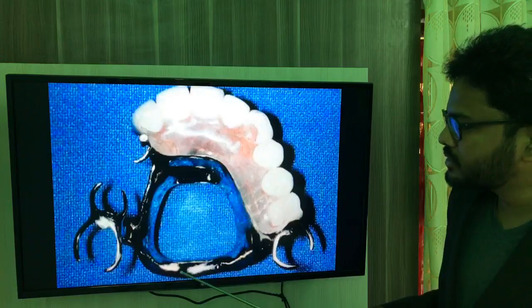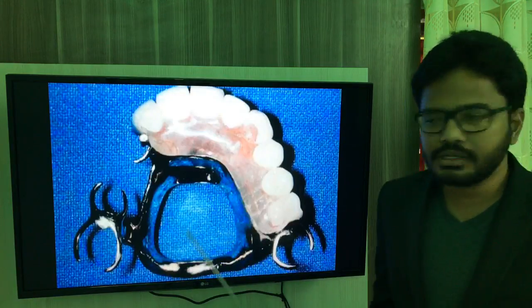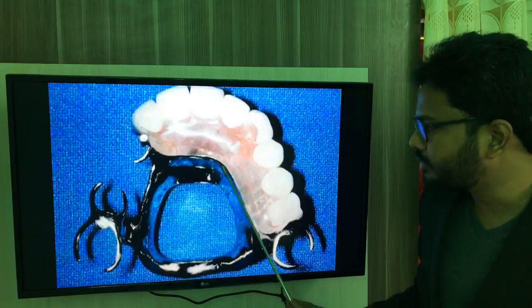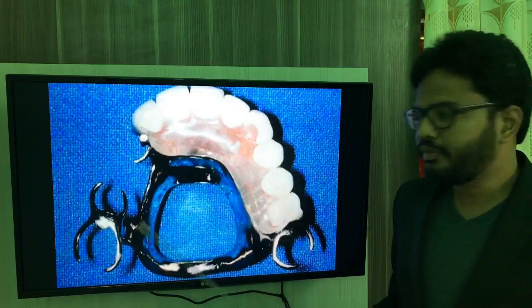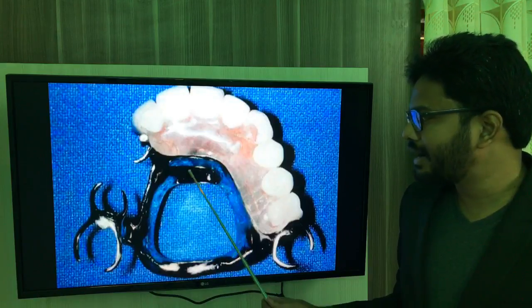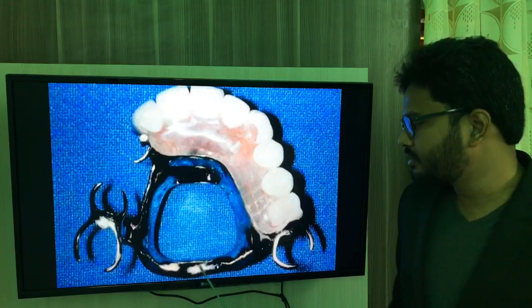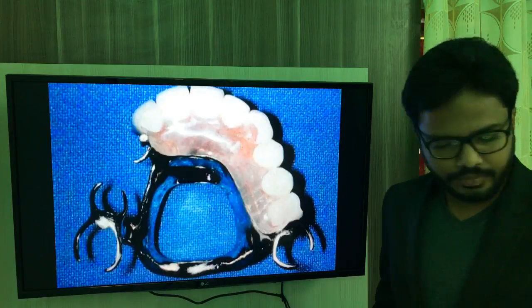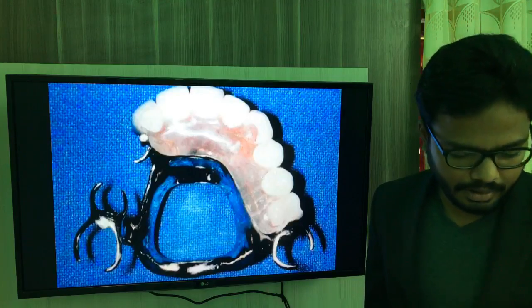So antero-posterior palatal bar, which is joined by 2 longitudinal elements, so that you'll have this circular effect. So anterior bar and posterior bar. In fact, anteriorly this is your palatal strap, which is modified, which is reduced in thickness, and this is a posterior bar, right? So antero-posterior bar or double palatal bar.